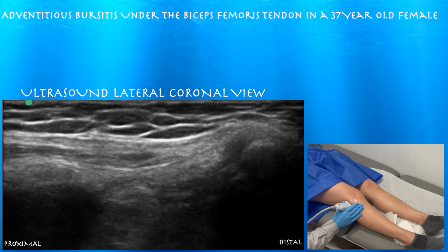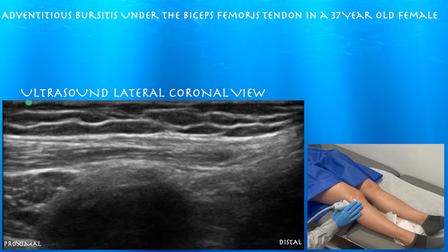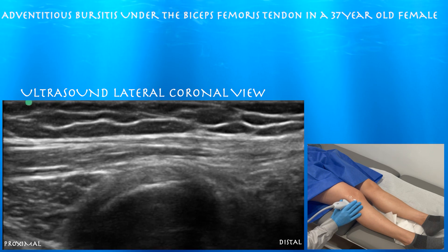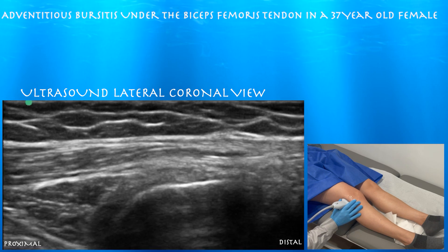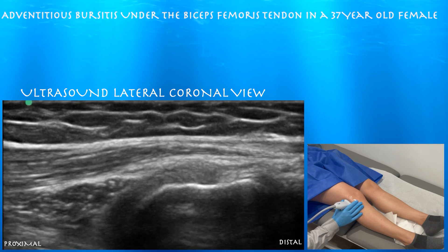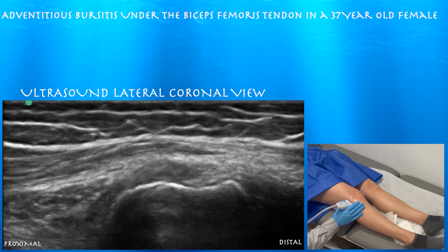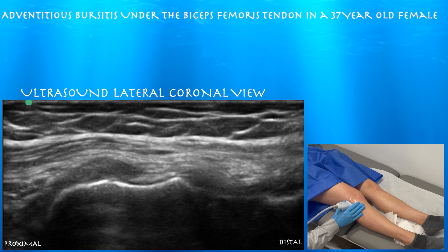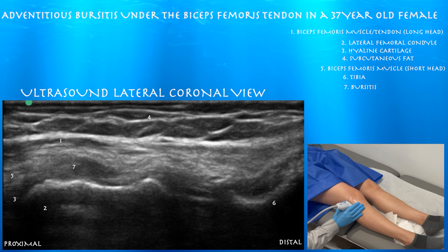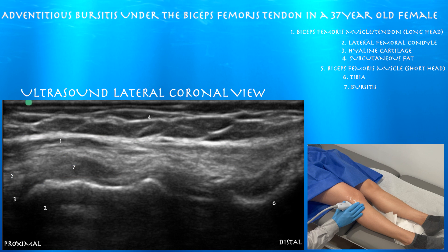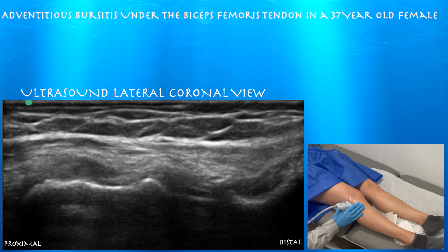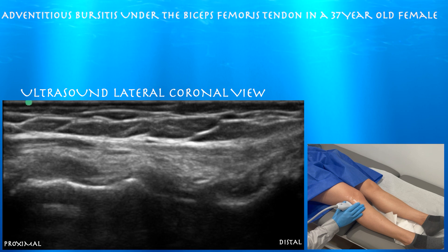Here we're going approximately again. We can see a nice-looking biceps femoris muscle basically feeding into the tendon. As the tendon goes distally, it splays over the fibula head — most of its anterior and posterior aspects — which is why you can see some broadening of the tendon distally here in this image.